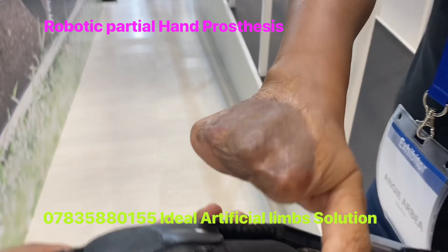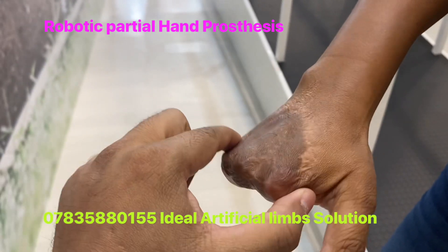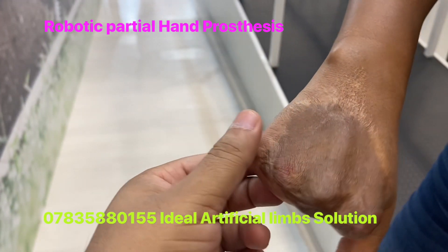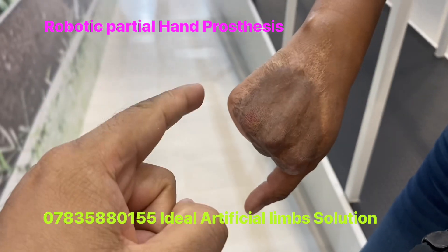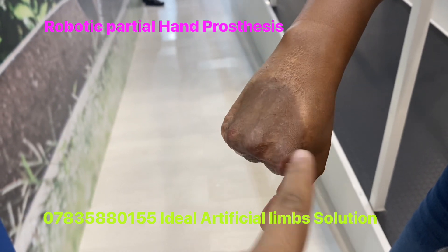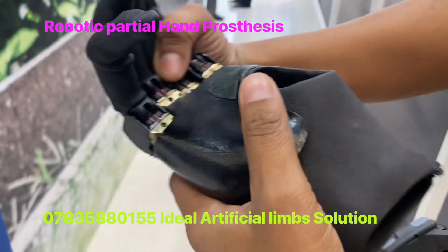The patient has a partial hand amputation. There is grafted skin over here. We are going to use one sensor here and a second one here to catch the muscle movement. This is for closing, this is for opening. These are the sensors.